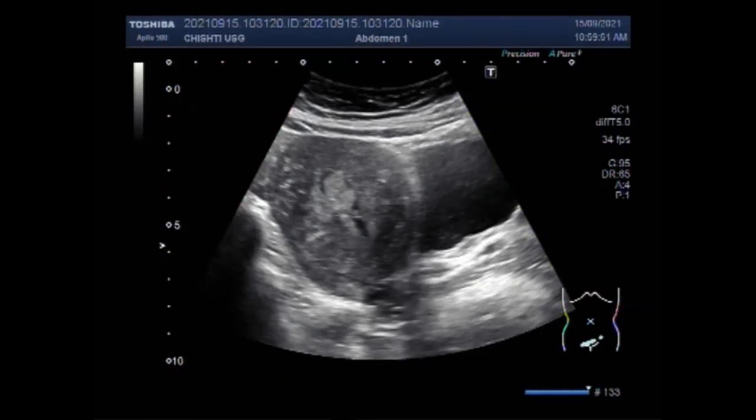Dear viewers, I hope you are all fine. This ultrasound video shows a case of pedunculated submucosal fibroid.